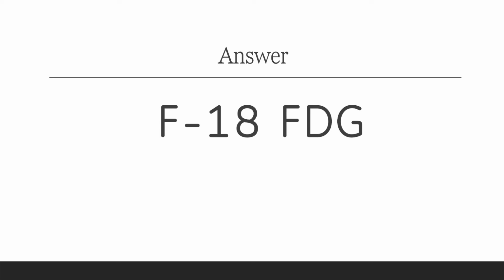What is the physical half-life of F18? 110 minutes. Good job. And what is the energy level of F18? 511 keV. Nice. You know your radionuclides.